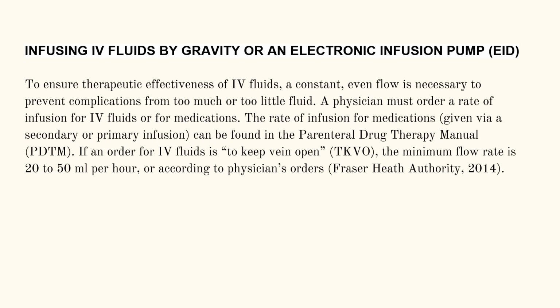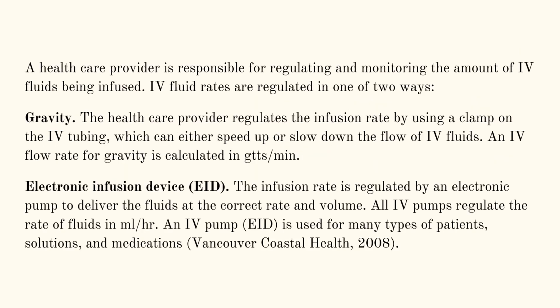The rate of the infusion for medications given via a secondary or primary infusion can be found in the manual, Parenteral Drug Therapy Manual. If an order for IV fluids is to keep vein open, or KVO, the minimum flow rate again is 20 to 50 mLs per hour, or according to physician's order. A healthcare provider is responsible for regulating and monitoring the amount of IV fluids being infused.